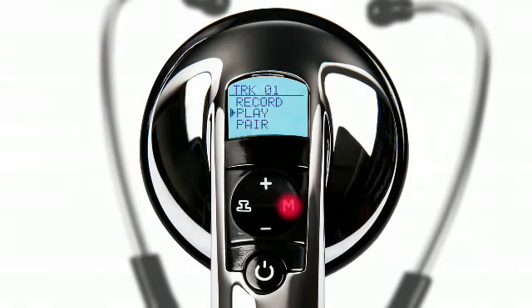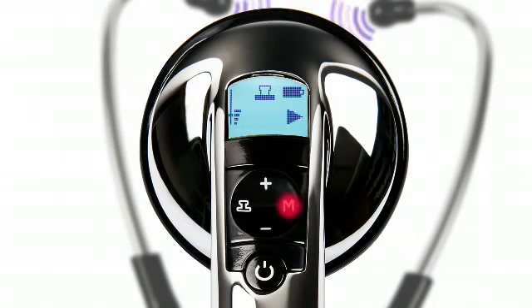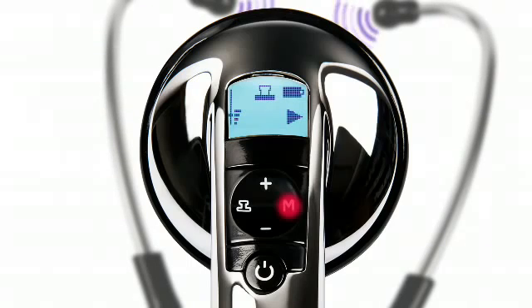To listen to what you've recorded, select play. The soundtrack will begin looping continuously. To stop the playback, press the M button.